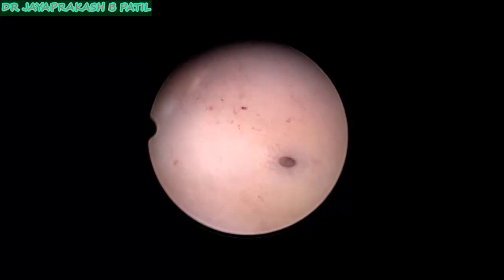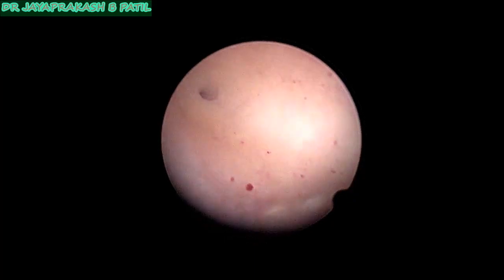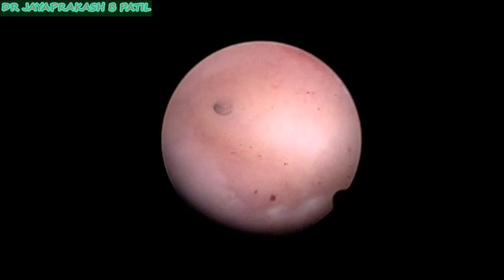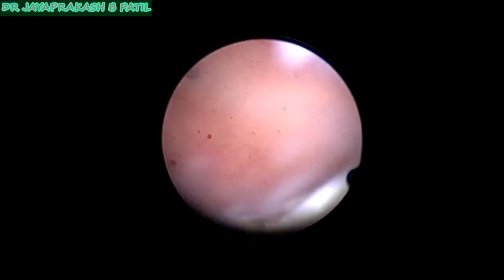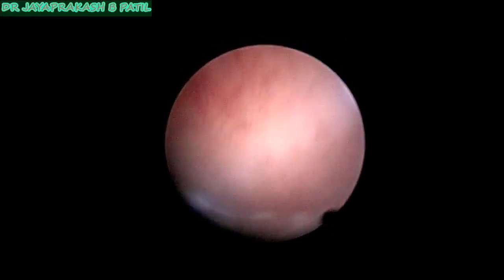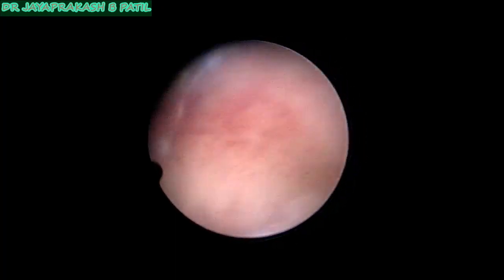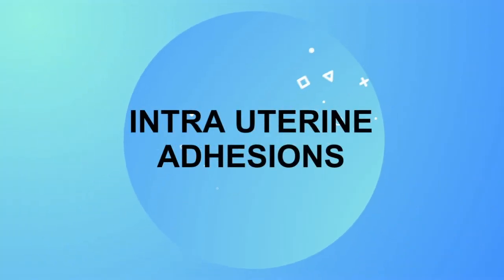Infertility evaluation is incomplete without hysteroscopic evaluation. Now we can see the cavity — whether there is any infection, sometimes a polyp, or any cavitary abnormalities within the uterus.